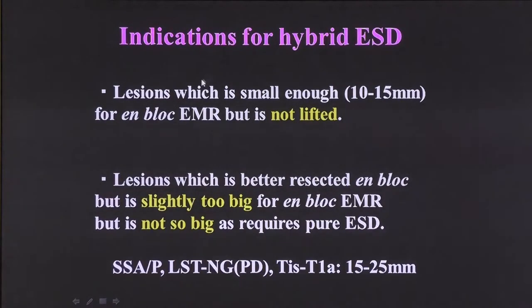Indications for hybrid ESD include lesions which are small enough for en bloc EMR but are not lifted. Another indication is lesions which are better resected en bloc, but are slightly too big for en bloc EMR, though not so big as to require pure ESD.